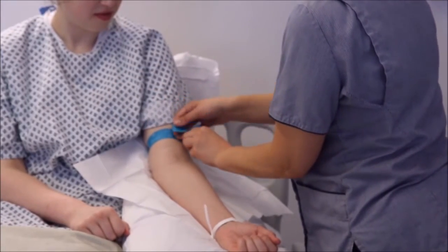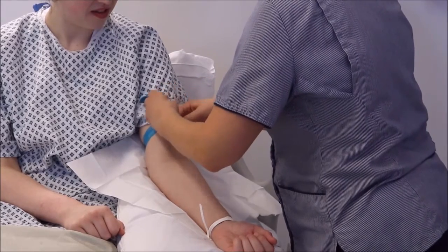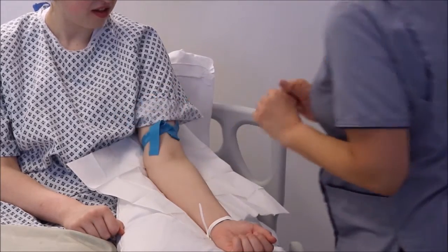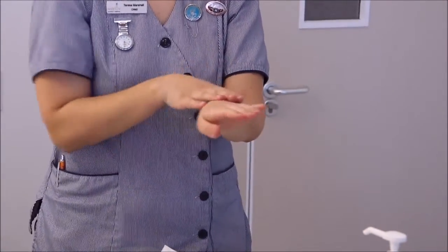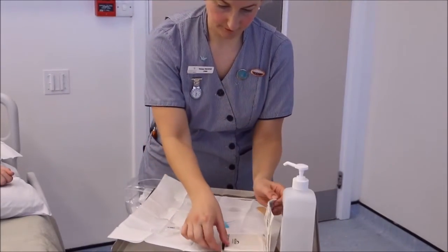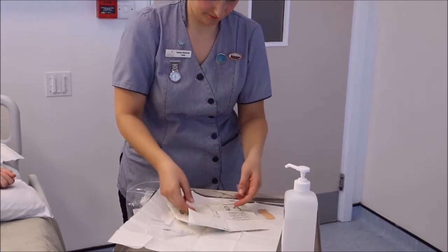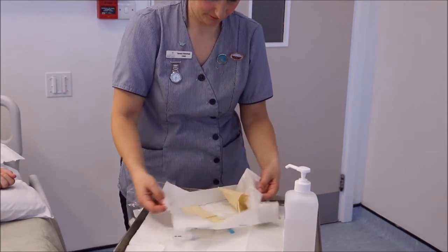Tighten the tourniquet. Decontaminate hands. Open and apply sterile gloves.